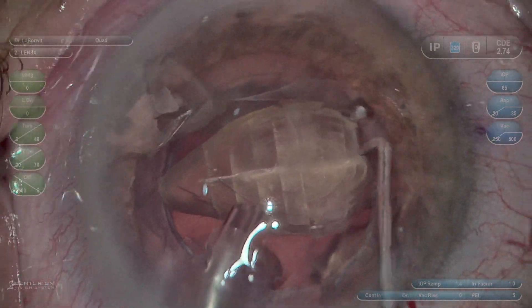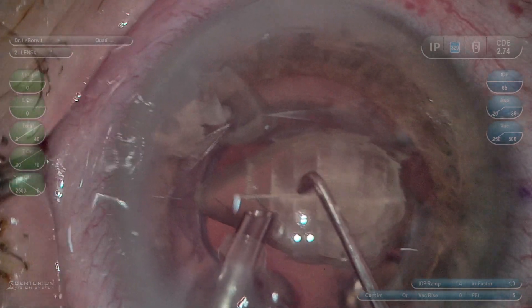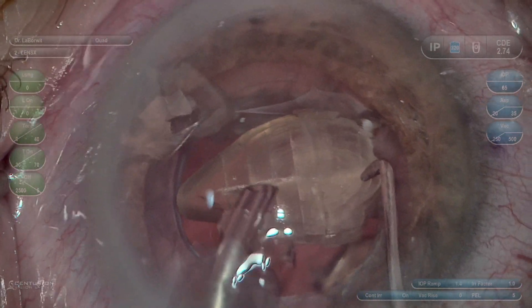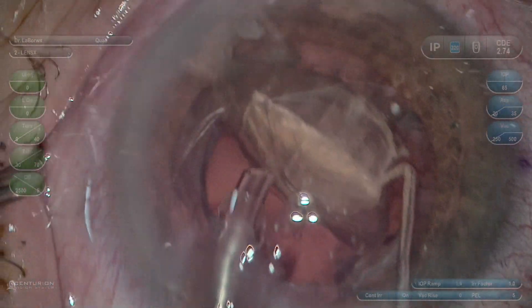Imagine if you did not have this horizontal cut — how the laser application would leave these longer pieces that have more surface area adhering to each other. So it literally breaks them up in half.